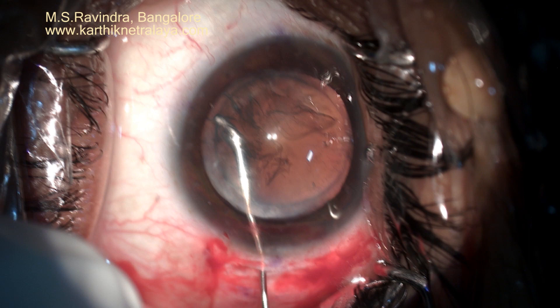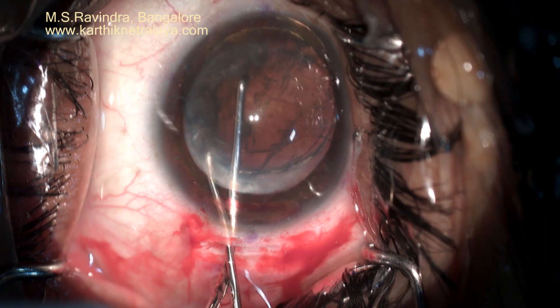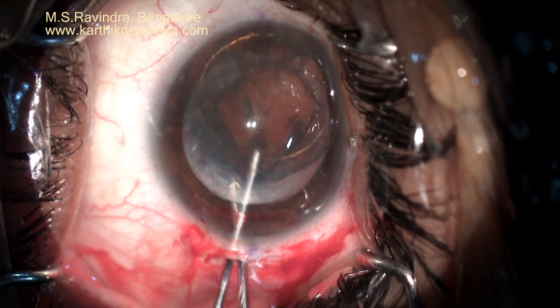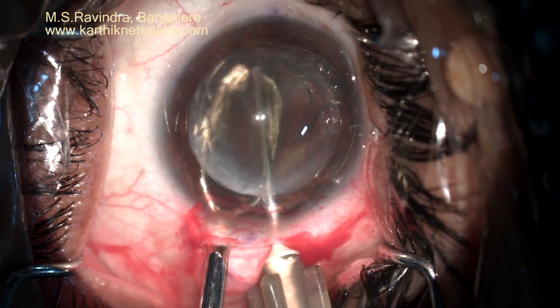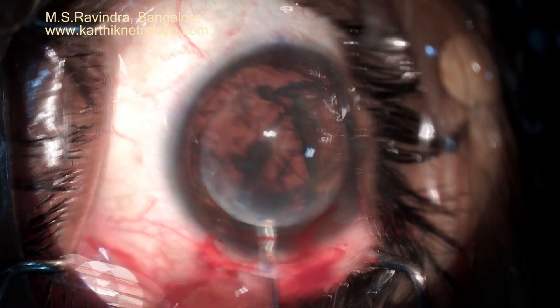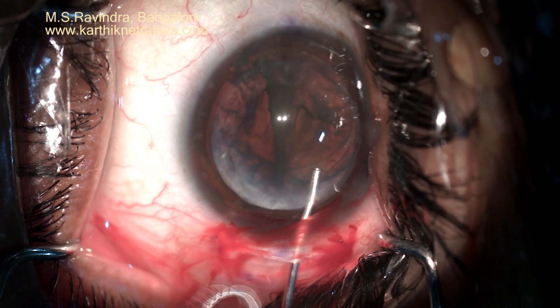A one-point hydrodissection is done with a special 27-gauge cannula. The nucleus is rotated manually into the anterior chamber without putting any traction on the zonules. The nucleus is bisected with the shaft of a 26-gauge cannula and is visco-expressed from the anterior chamber without any pressure or any touch to the endothelium.